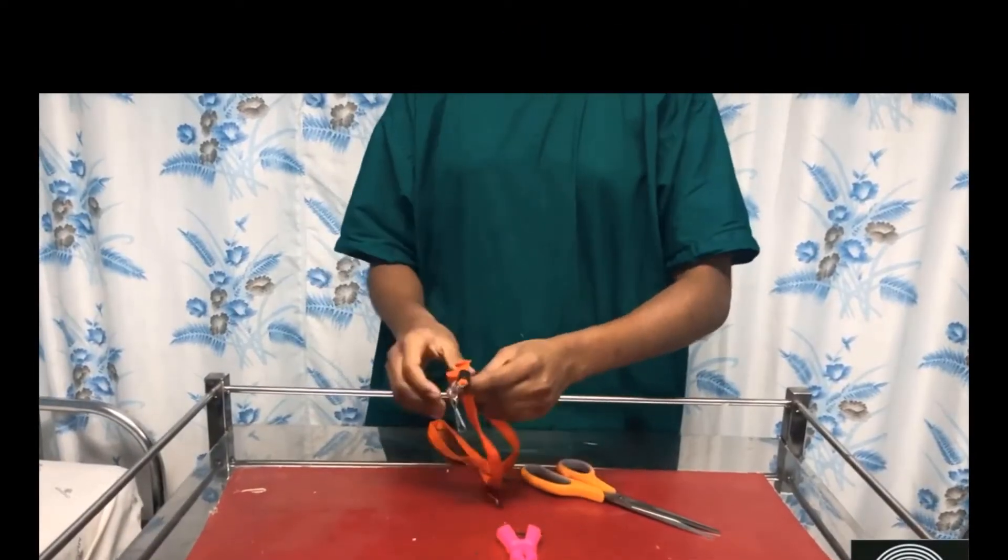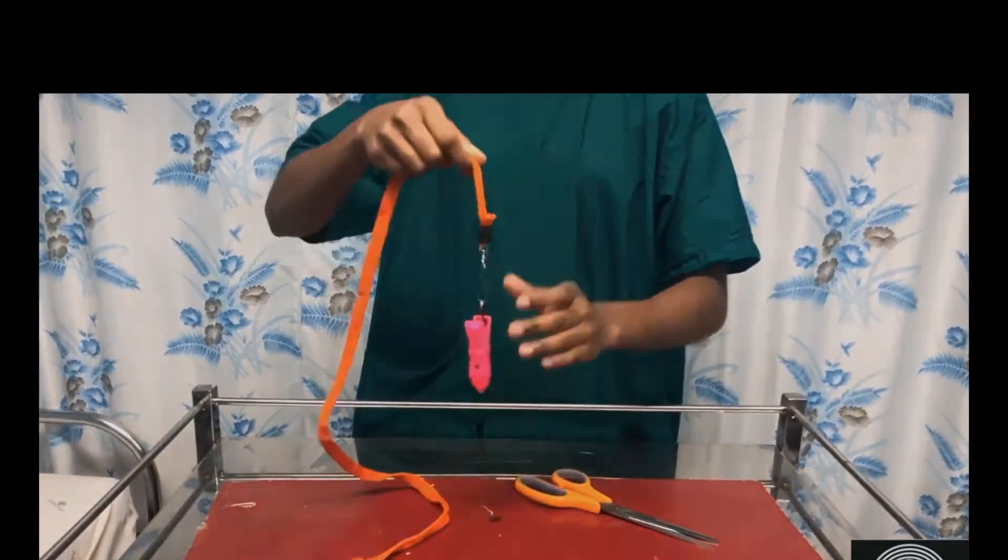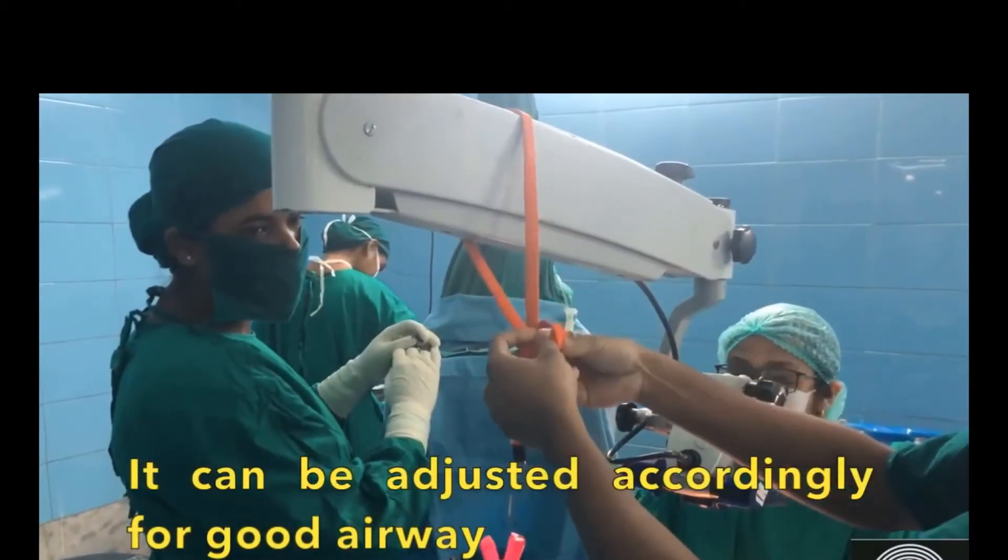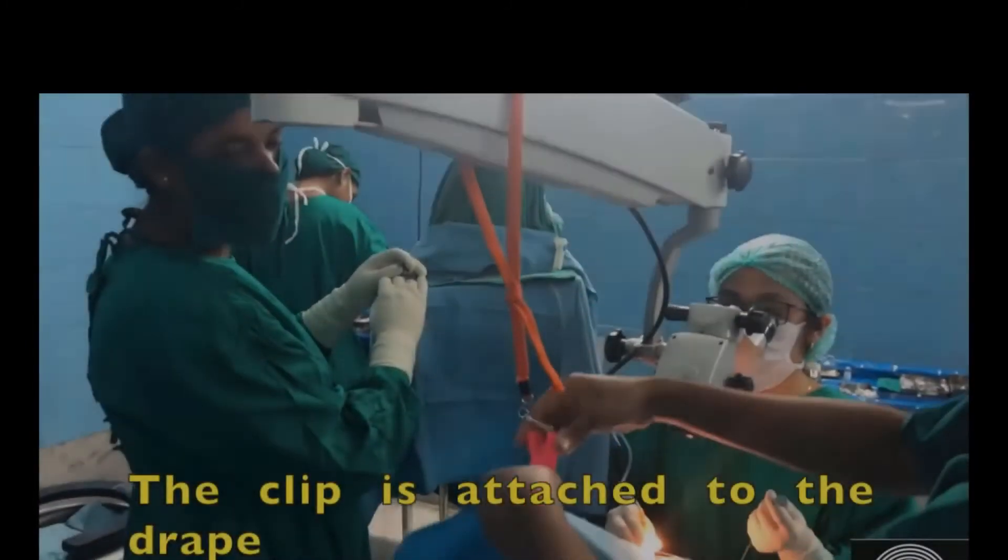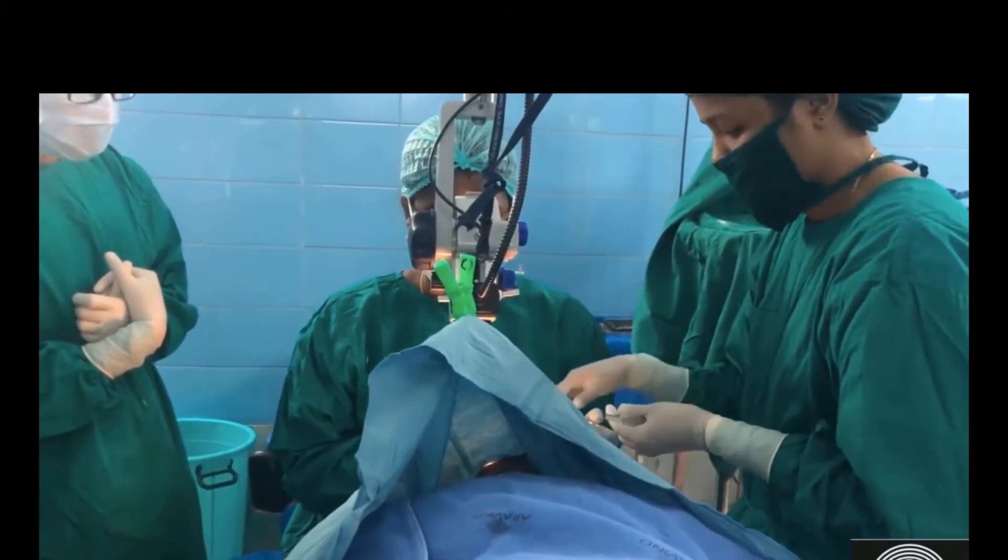5 cent airway for patients to breathe easily during surgery. The lanyard that is thrown away after each conference can be reused in this manner. One end of the lanyard is tied to the microscope and the other end is clipped onto the drape during surgery. It also has a sliding node to adjust the drape height.